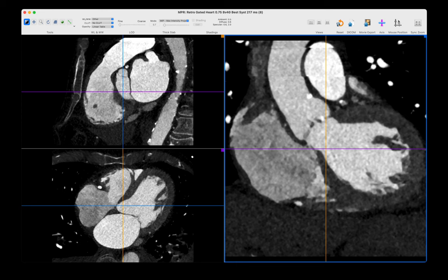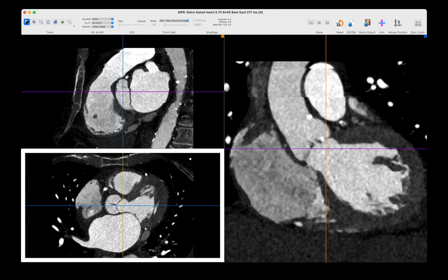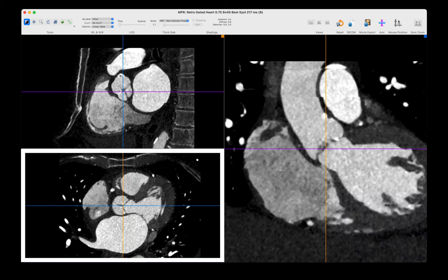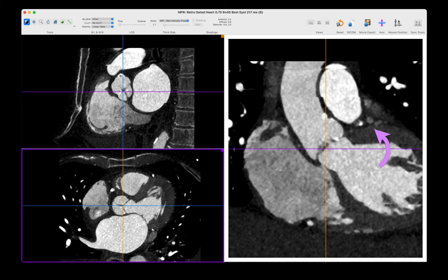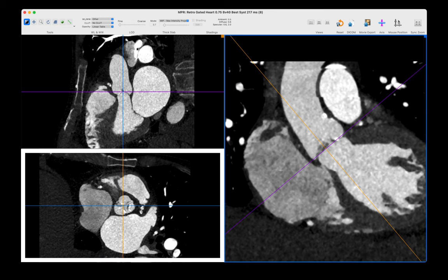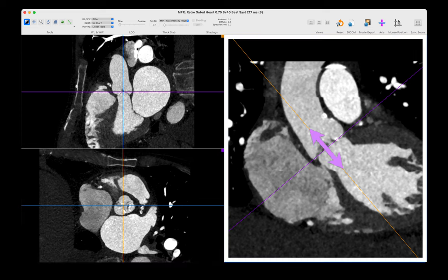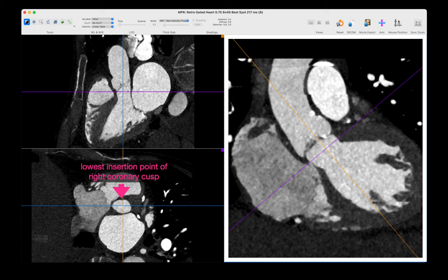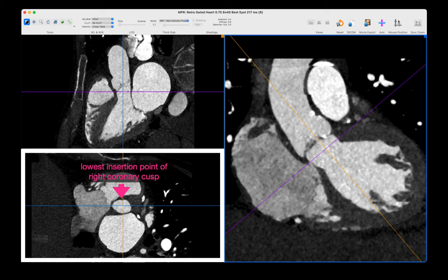Open the cardiac CT volume in a 3D MPR view, typically choosing the systolic phase of the cardiac cycle, somewhere between the 20% to 40% phase. Scroll to the level of the aortic valve on your axial view and position the crosshairs on top of the aortic valve. Now go to your coronal image and rotate the crosshairs to crudely approximate the aortic valve plane on your former axial view. This is your crude aortic valve plane. Translate the crosshairs on your coronal image up and down to identify the lowest insertion point of the right coronary cusp, which is usually near the 12 to 1 o'clock position on your former axial view, and position the crosshairs exactly at this point.